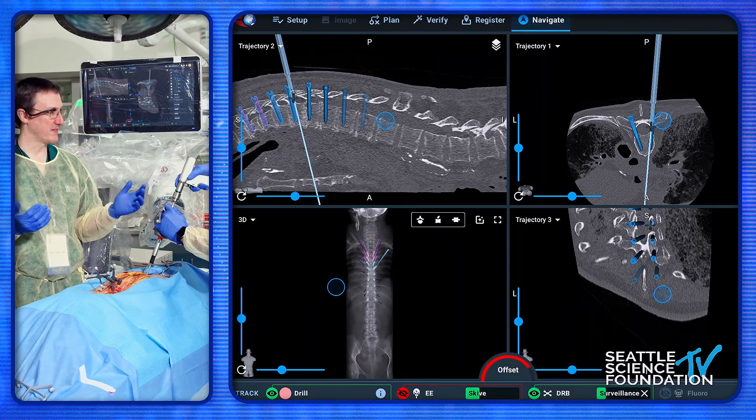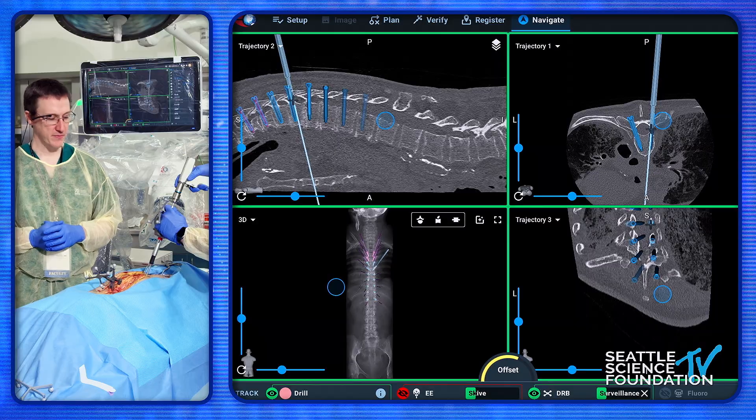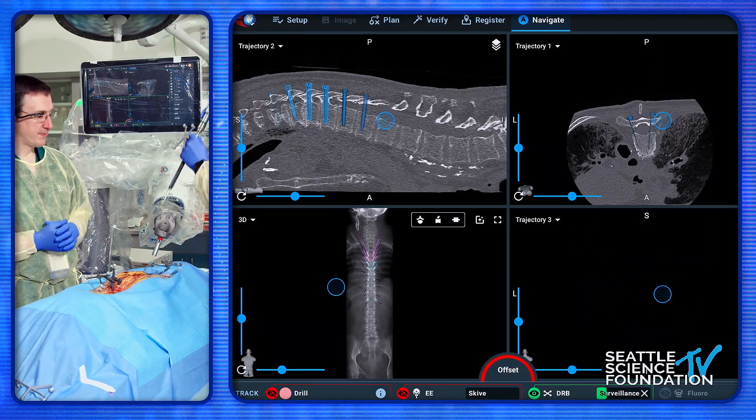You can feel it — so we talk about the haptic feedback — you can actually feel when you're there.